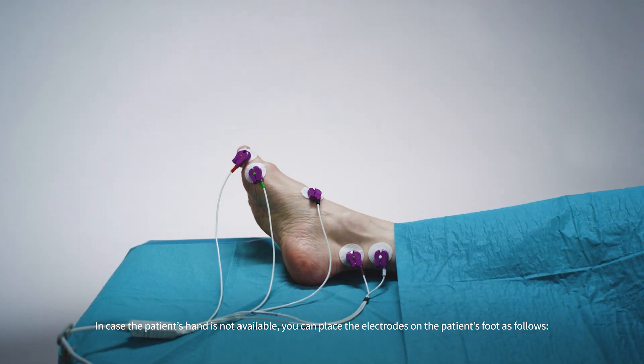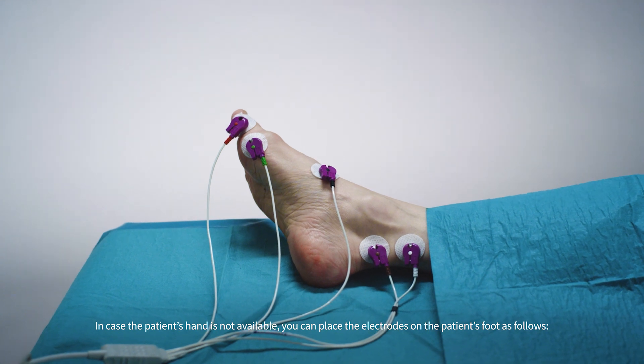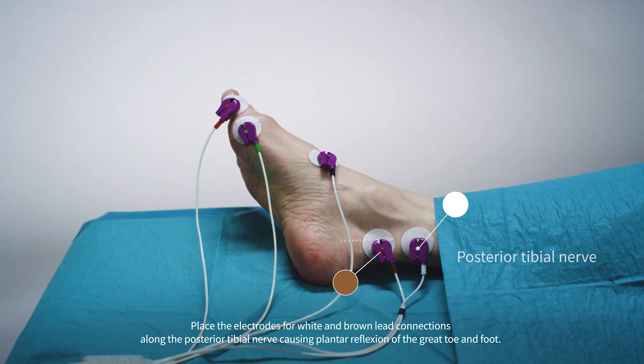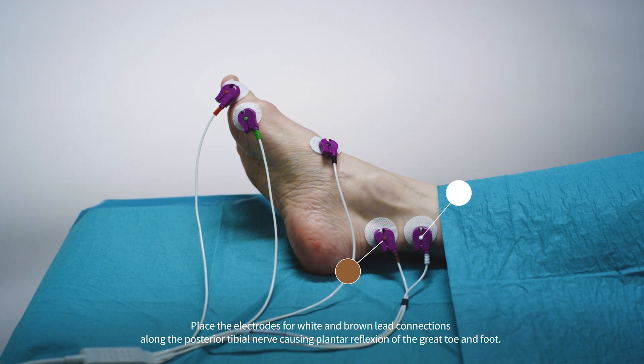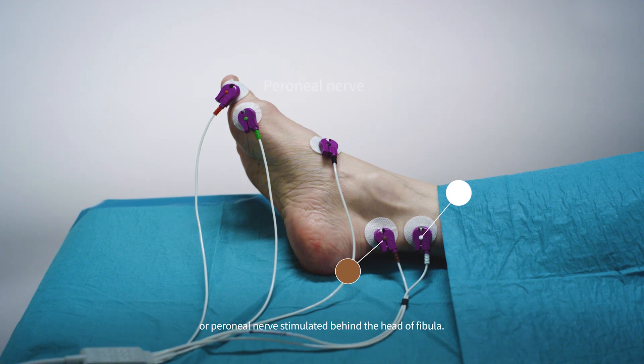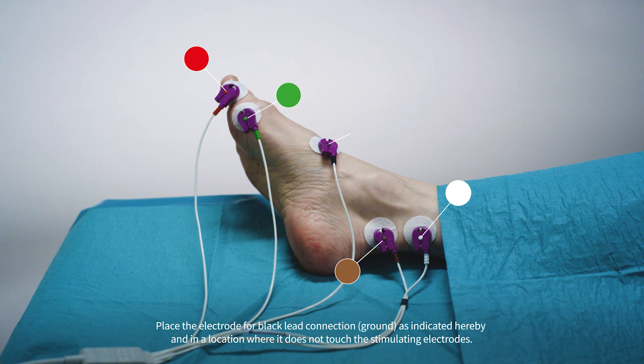In case the patient's hand is not available, you can place the electrodes on the patient's foot as follows. Place the electrodes for white and brown lead connections along the posterior tibial nerve, causing plantar flexion of the great toe and foot, or the peroneal nerve stimulated behind the head of the fibula. Place the electrodes for red and green lead connection sites on the musculus flexor hallucis brevis. Place the electrode for black lead connection ground as indicated in a location where it does not touch the stimulating electrodes.